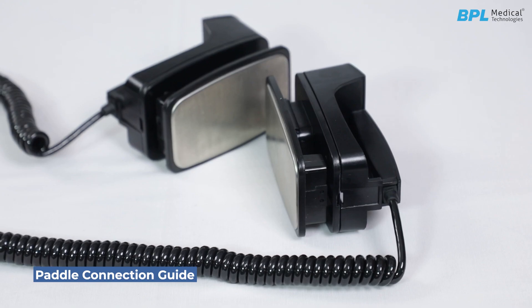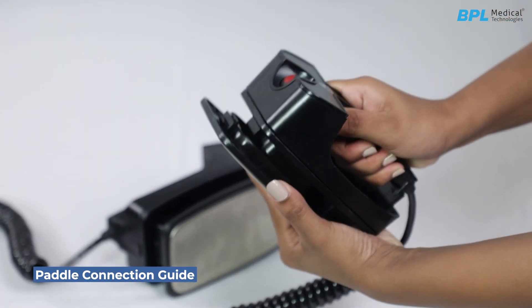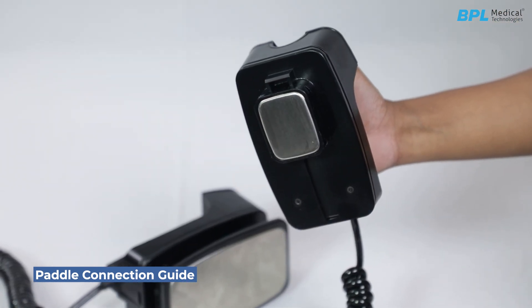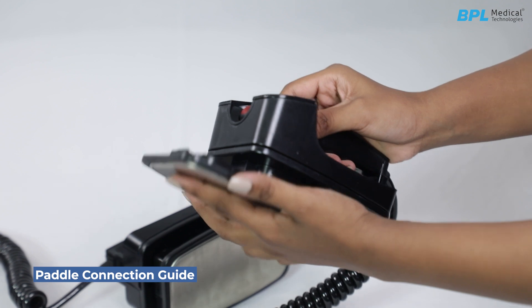Paddle connection guide — switching to pediatric paddle. To use the pediatric paddle on the standard external paddle, slide the adult paddle forward after releasing the latch on the top. Once the adult paddle extends fully, it reveals the pediatric surface. Remember to return the adult paddle after use.